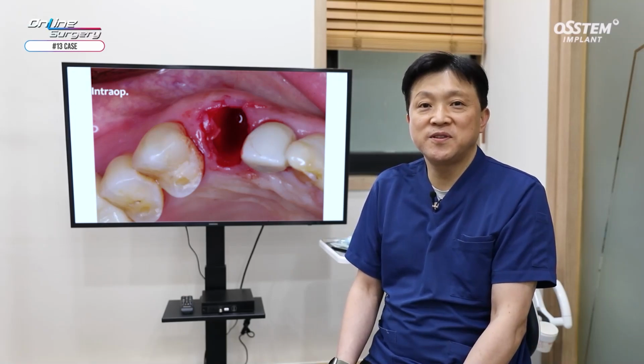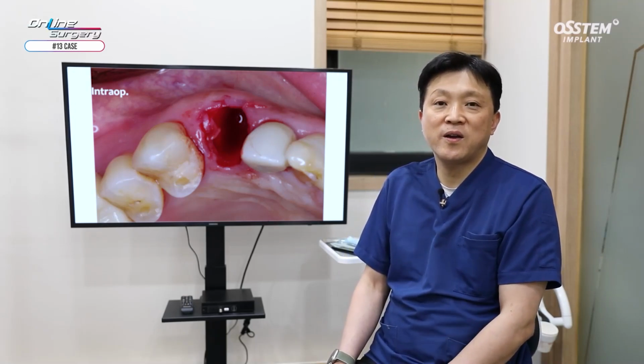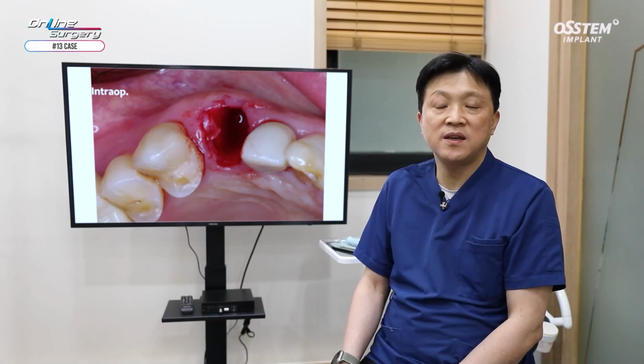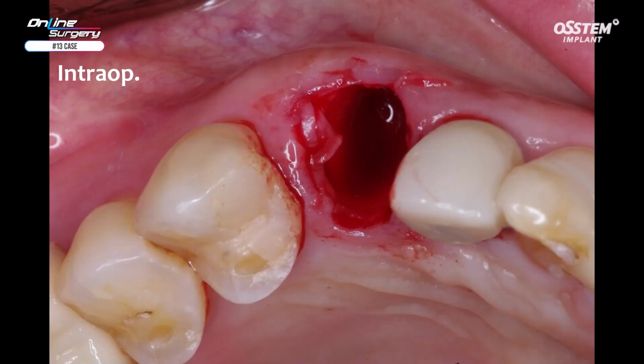Did you enjoy the video? Now let's review the surgical process and look at the results. First, extraction was done. Atraumatic extraction is favorable, so periotome was used for extraction. This was after extraction. Guide was adapted.